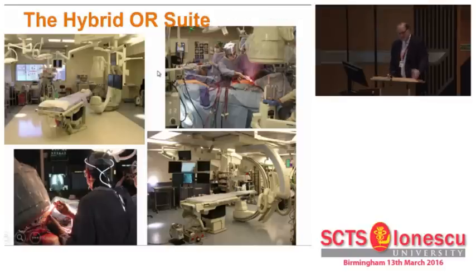Now, these are all done in our endovascular suites, and for the entire revolution that's going to be coming in aortic surgery, every cardiac surgical system needs to have a very advanced hybrid operating room endo suite. I just was at Mayo Clinic and saw their most recent one, and we have one as well. The new GEs, for example, are incredible, just incredible. What we can do with them is for endovascular TAAAs and endovascular arches that are coming down the pike. These are going to be very, very important. In fact, they can't be done. So we're going to lose out. We're not going to be able to do this stuff unless you have one.